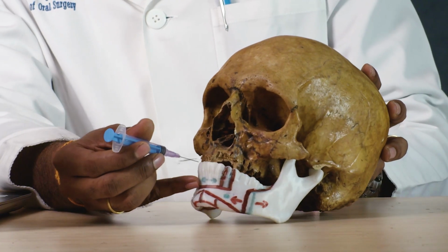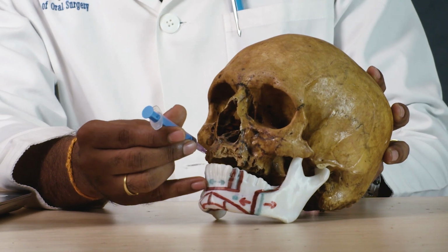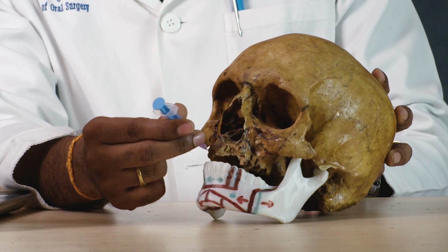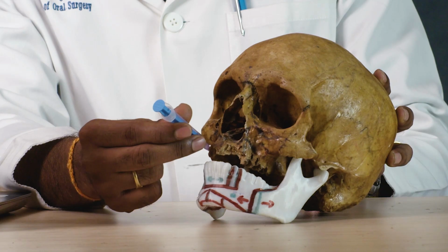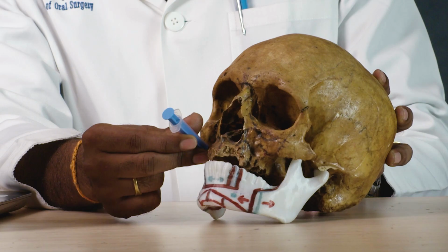So, we have to see for the mucogingival junction of maxillary second and third molar region near the tuberosity, and the syringe held parallel to the maxillary occlusal plane and medial to the mandibular ramus. We have to proceed further inside. So, approximately the depth of insertion being 23 to 25 mm.